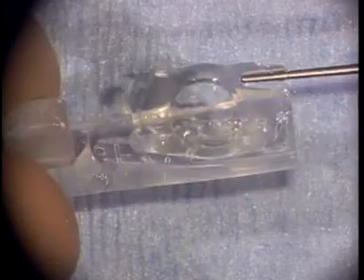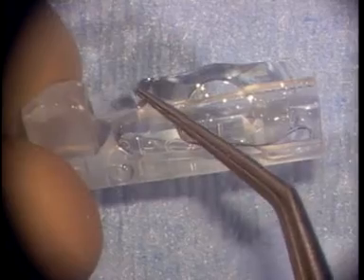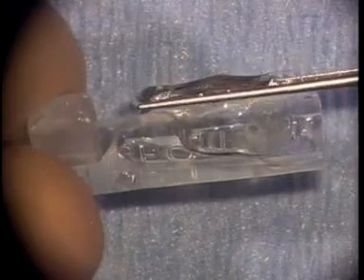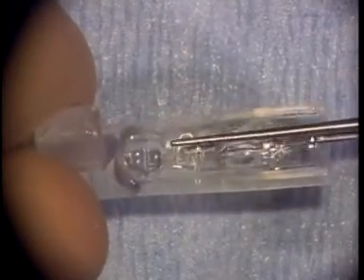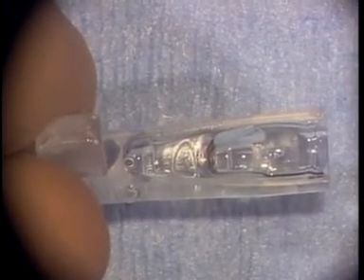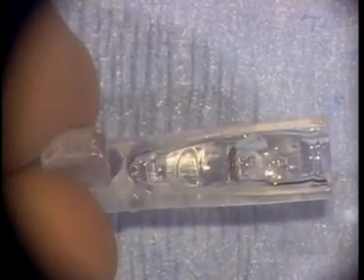With the cartridge in one hand and the forceps holding the ICL in the other, place the ICL into the cartridge bay so that the long axis of the lens is positioned into the groove, under each side rail of the cartridge. This usually requires starting one long edge of the ICL under one rail and rolling the wrist to position the opposite side of the ICL under the opposing rail. Remember that the ICL must be convex in the cartridge, with both edges below the side grooves of the cartridge.